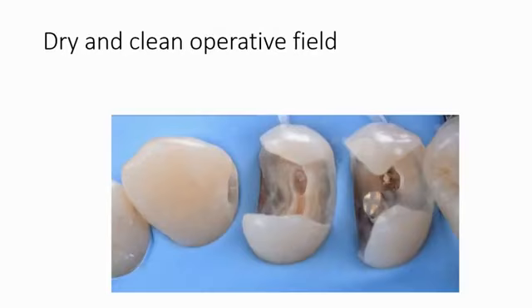First of all, I always try to discuss the benefits, because there are many benefits other than the basic isolation, and by seeing these benefits you will start loving to use the rubber dam from day one in your practice. First, you get a dry and clean operative field. Remember, when you are doing a root canal, an obturation, a good composite or any procedure, and the field is exposed, you can see the gums, the cheek and the tongue coming all around. After using this rubber dam technique, by following the various steps I'll be telling you, you can perform the procedures so beautifully.